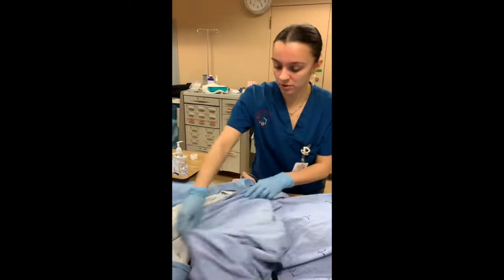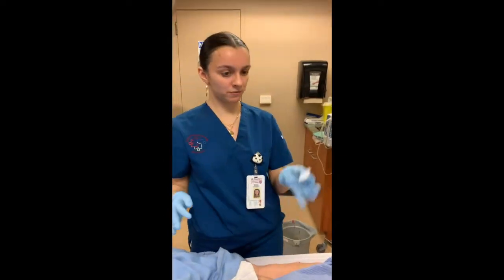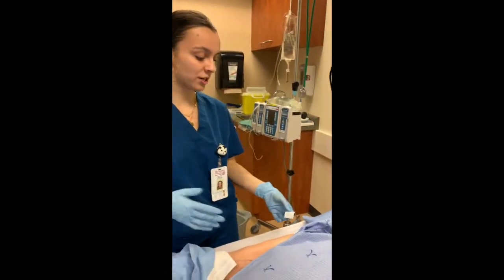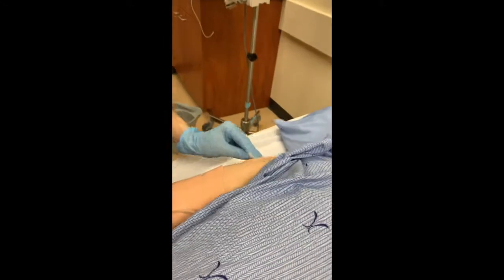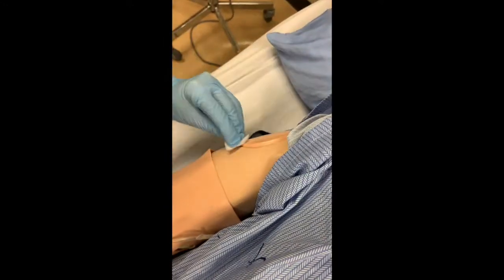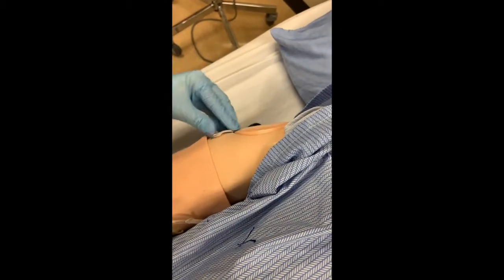Okay. So now I'm going to be giving the intramuscular injection. So what I'm going to be doing first before the injection, I'm just going to clean the area for approximately 30 seconds, as you would do in a real clinical setting. So just going to make sure everything is clean around it with these alcohol wipes. In a real clinical setting, you would do this for approximately 30 seconds. Okay. So now we can get on with the injection.